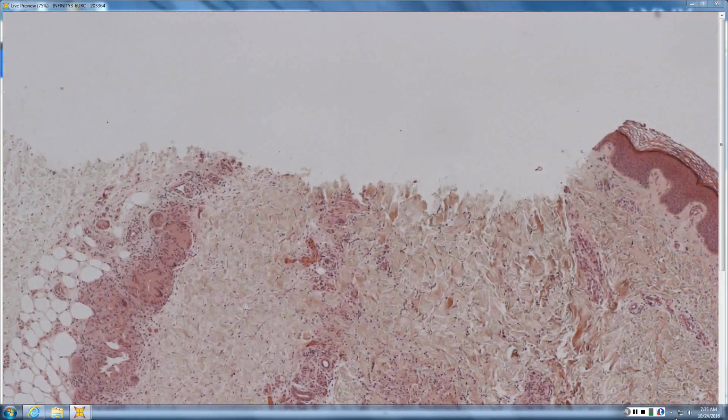It looks like we have some giant cells down deep there at the junction. Giant cells, when they're put together, form a granuloma. Granuloma, correct. So we have a granulomatous condition. And the granuloma is oriented in what direction? Horizontally. So that raises one possibility.